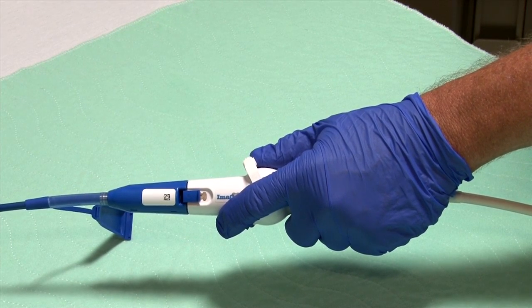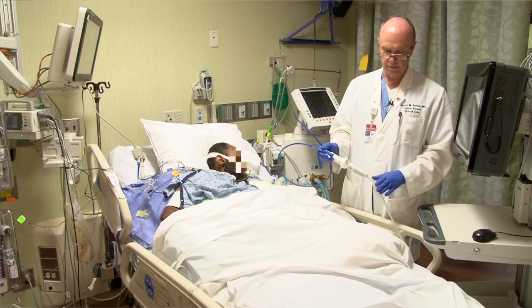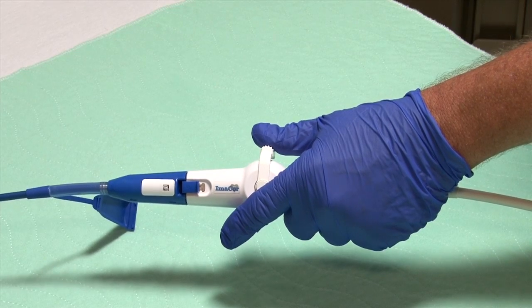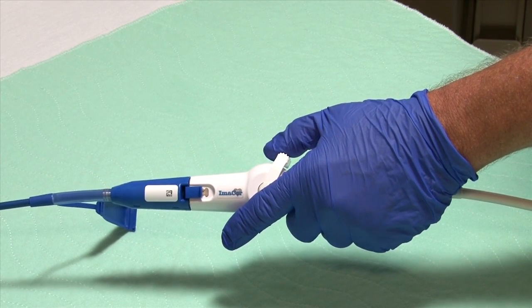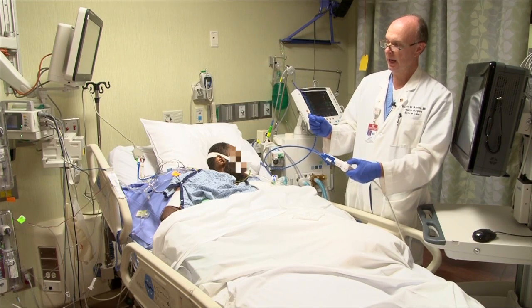You see the probe move here in a retroflex fashion, or if we move the lever away from the probe toward the end of the handle, that's anteflex and you can see the probe move in a different direction. Let's do that again — retroflex, anteflex.